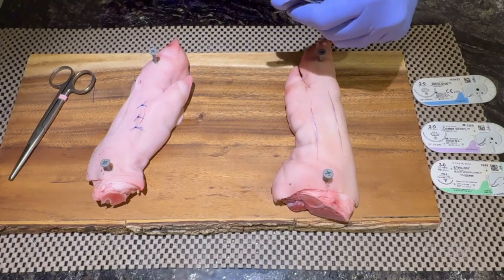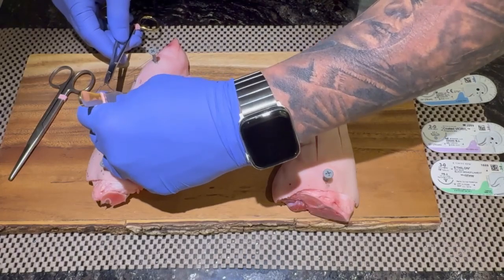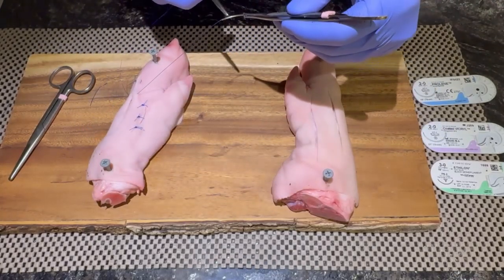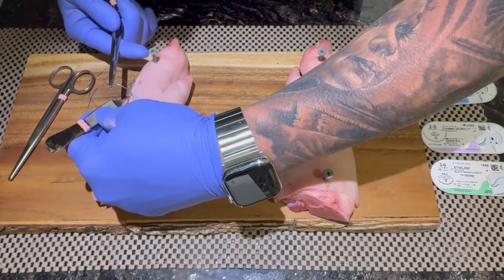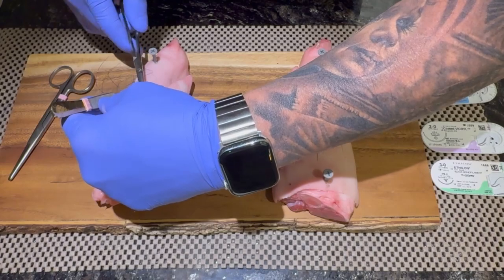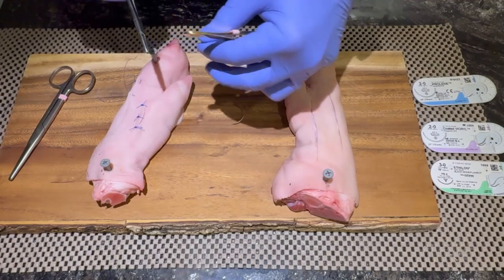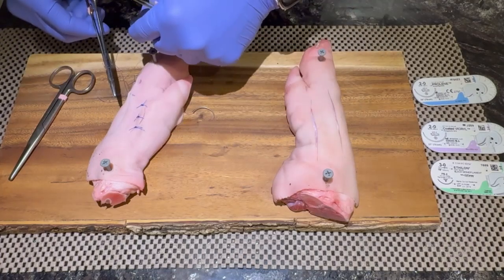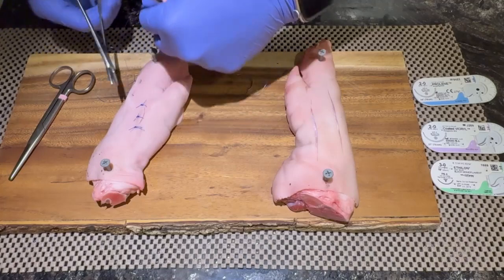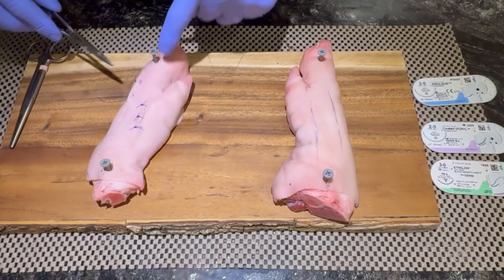Or we can have a vertical mattress, in which the suture runs perpendicular to the wound. We go a little bit farther from the wound, and then we come out farther. So now we go to the other side by going close and more shallow on the skin. With the non-dominant hand, get the tail with the needle holder, 2 loops in front, grab it, make your first tight, then go backward, tight, and then go forward. These loops have to go against each other, so you make sure that the suture will never get loose. So this is a horizontal mattress, and this is a vertical mattress.